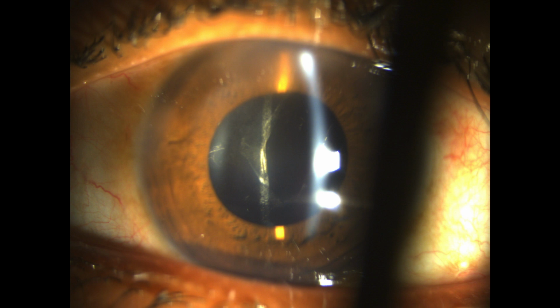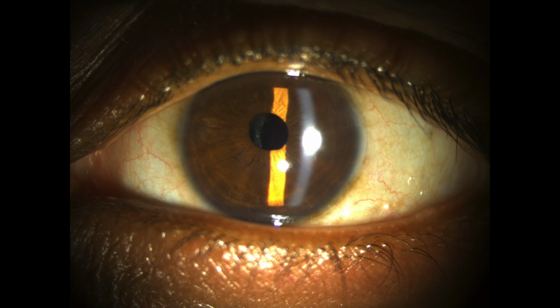This is on the same day as the surgery, you can see the lens, and this is after 3 days.